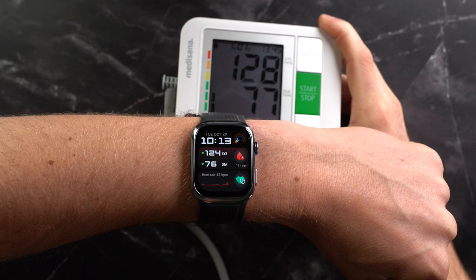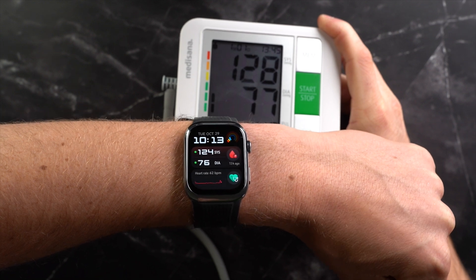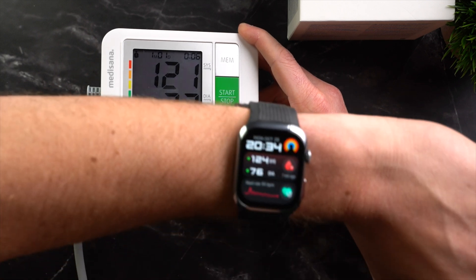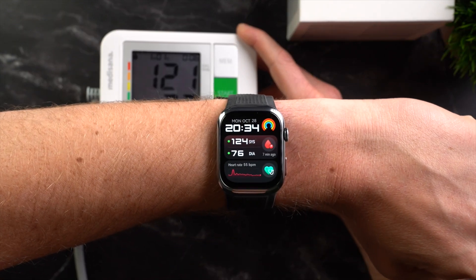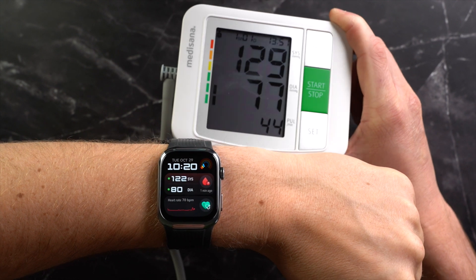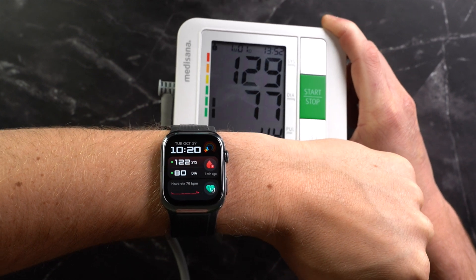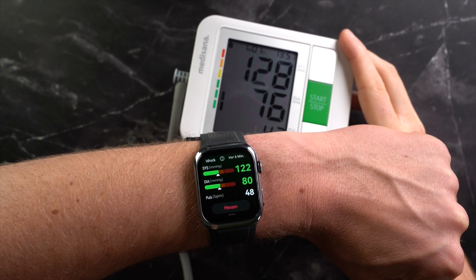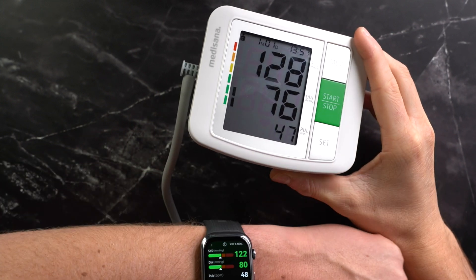But how accurate is it? I measured my blood pressure every day for 30 consecutive days using both the watch and a traditional arm cuff, then compared the values. Here you can see some of the results — sometimes I tested in the morning, sometimes in the evening, and under various conditions. The deviation between the smartwatch and the blood pressure monitor was mostly between 3 and 5%, which is perfectly fine. In my case, these values are within the normal healthy range.